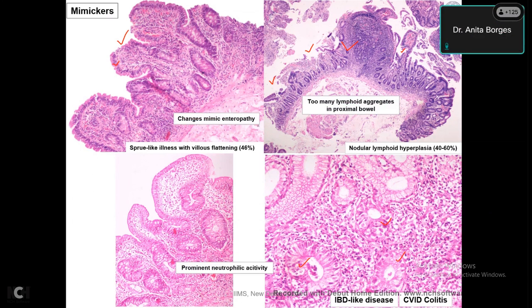Prasanjit, yes, ma'am. There is a question here, and since you've got the small bowel up, please clear up the crypt-villus ratio, how to analyze. Can you please, because you have the small bowel up here. Yes, yes. I will quickly touch on that.